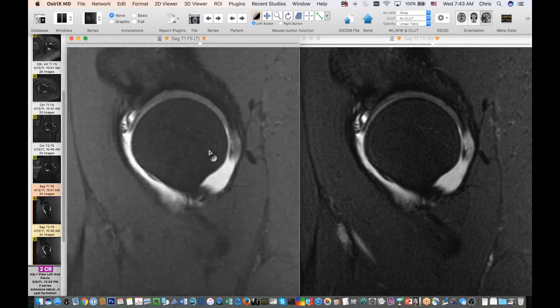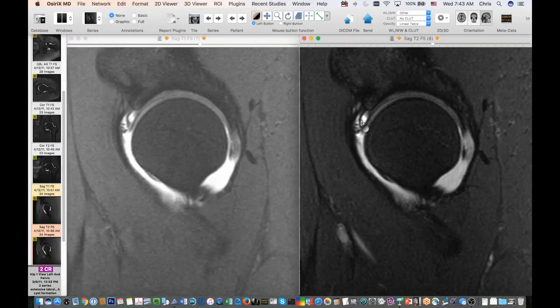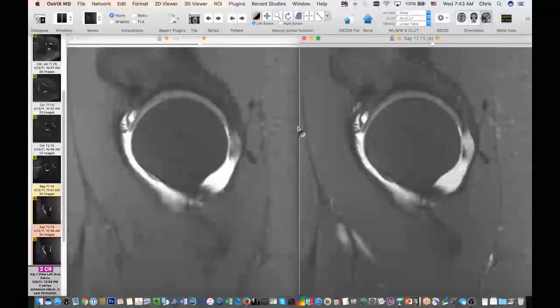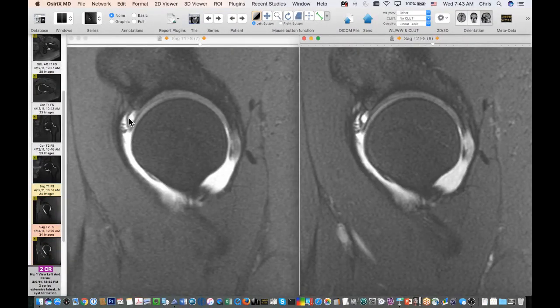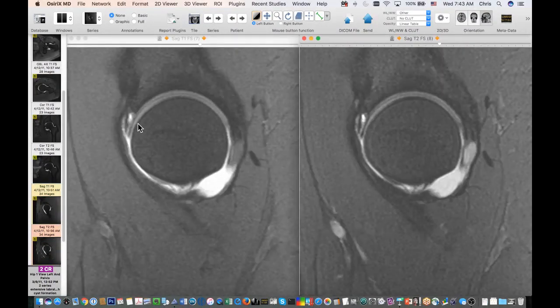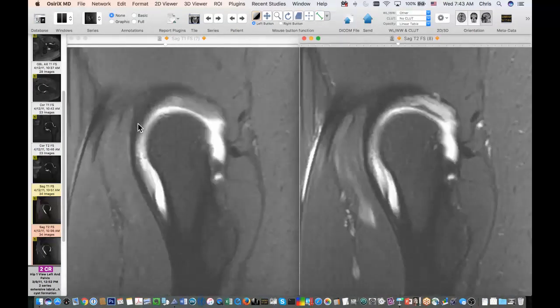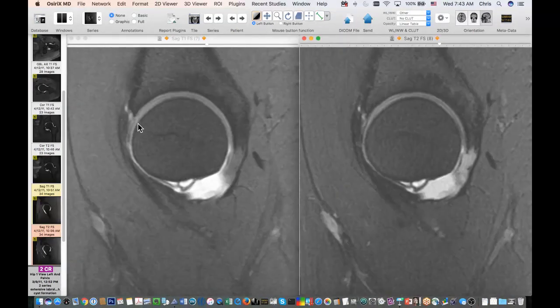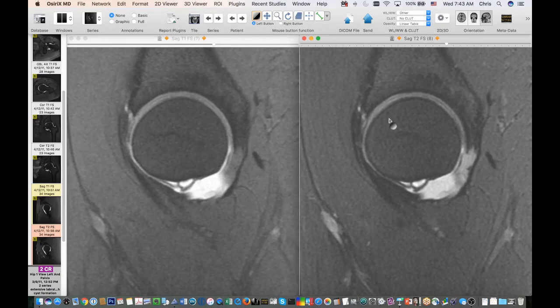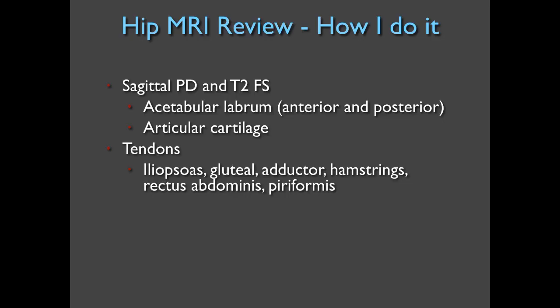On the sagittal image here, you can see the acetabular labrum anteriorly with increased intra-substance signal within it. There's a large cyst forming within the labrum — cystic change and degeneration in the setting of a labral tear. In this patient, the articular cartilage is actually pretty much intact — you can see the thin layers of cartilage. That's a quick tour of some of the MR imaging anatomy.